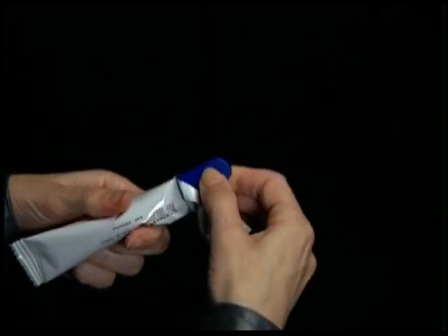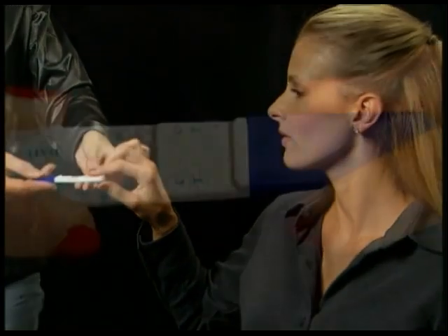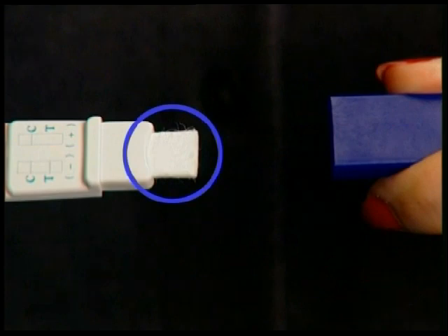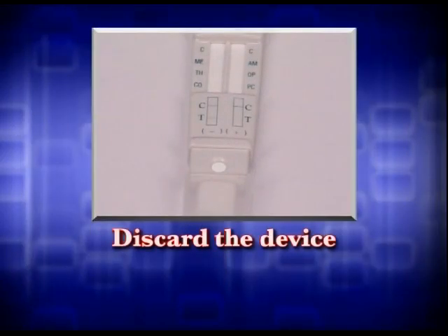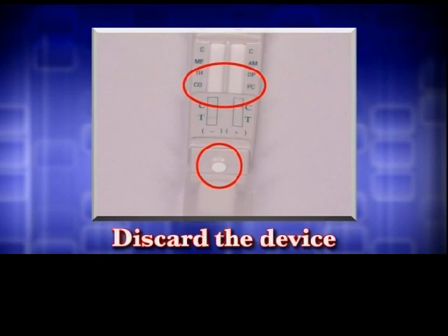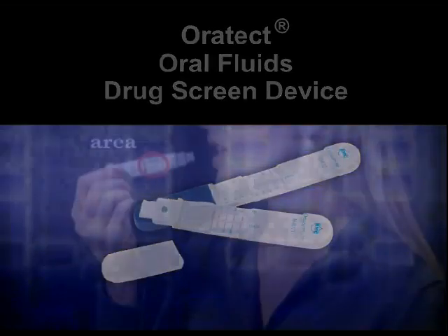Request the donor to carefully remove the blue or clear cap by holding the sides and gently pulling the cap off of the device. This will expose the collection pad. Make sure there is a blue line present in each drug test window. If there are no blue lines present in the drug test windows, discard the test and use another device. The oral fluid collection process must be strictly observed.